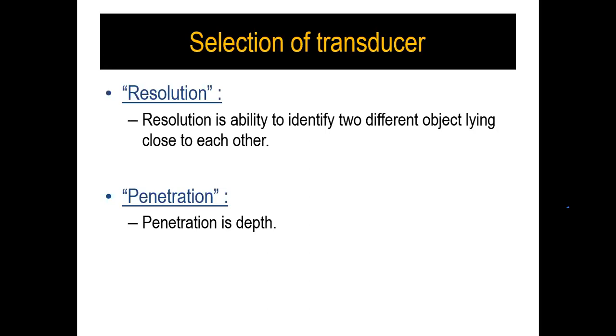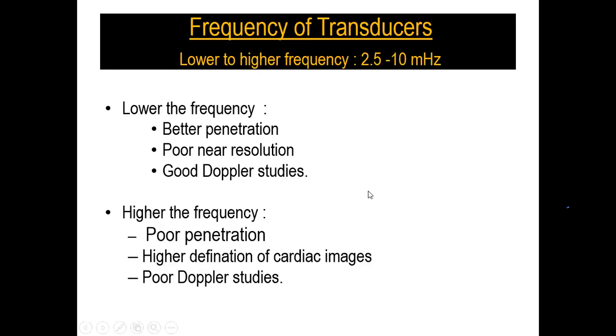That's what the word penetration means. Based on this resolution and penetration, we talk of the transducer, and that is about frequency, which determines what kind of transducer we should use in our clinical practice.